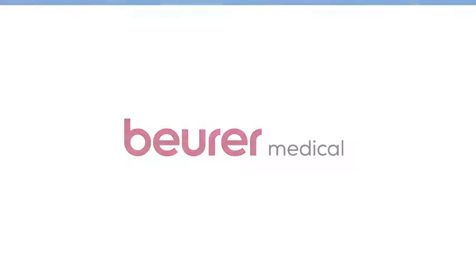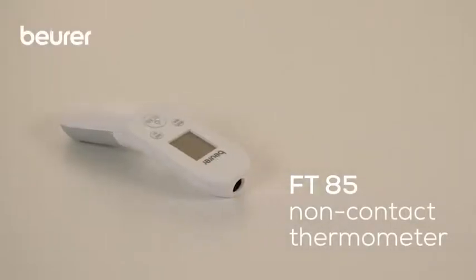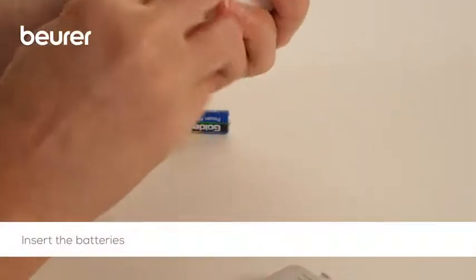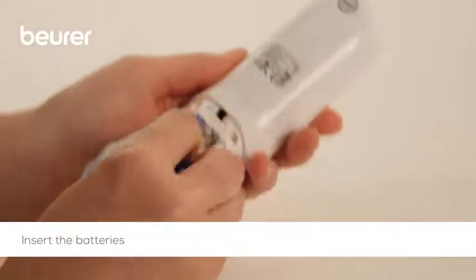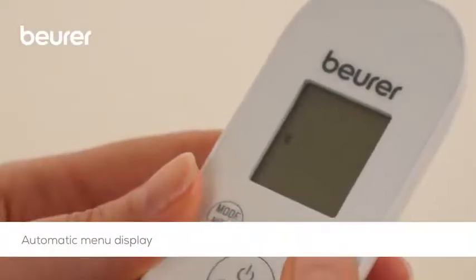Here are some tips on using your non-contact FT85 clinical thermometer from Boira. First, insert the batteries into the battery compartment. The thermometer automatically switches on and the settings menu appears in the display.